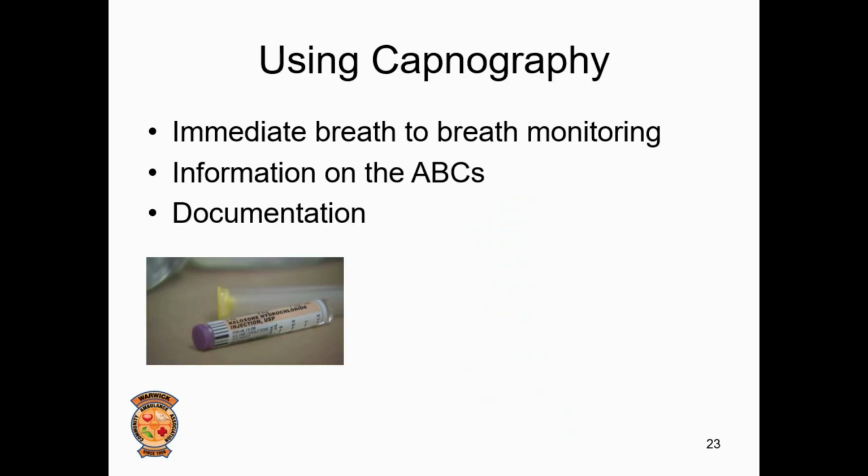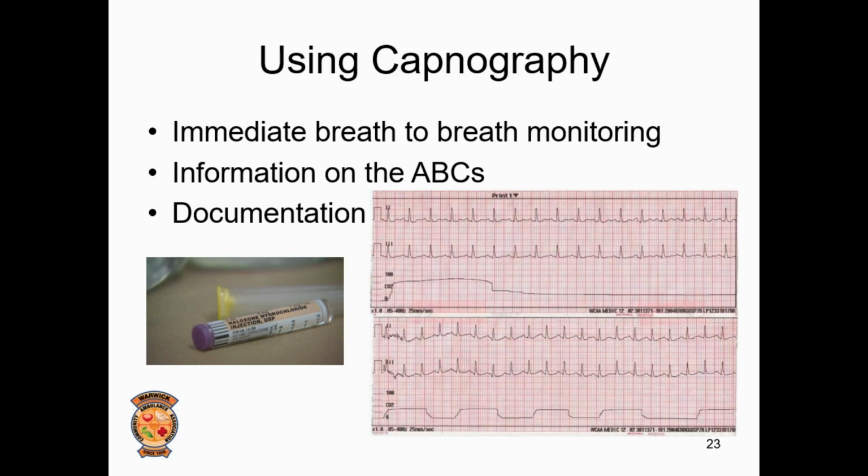So what are we going to use capnography for? We can measure the patient's ventilatory status on a breath-to-breath basis. Capnography provides real-time information about the ABCs, and we can use it to objectively document our treatment.